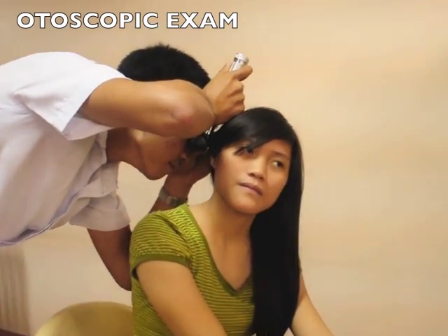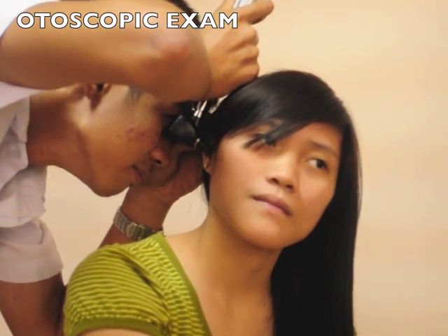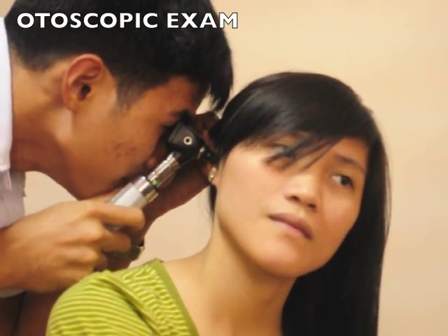Use the shortest and largest speculum that will accommodate the ear canal. Have the patient tilt head in the opposite direction. Hold the otoscope like a pen with the handle up, resting hand on the patient's head. Or hold the otoscope like a pen with the handle down and look through the magnifying lens.